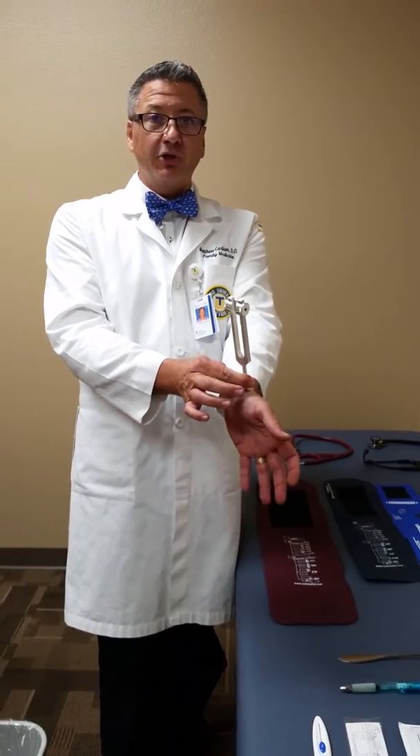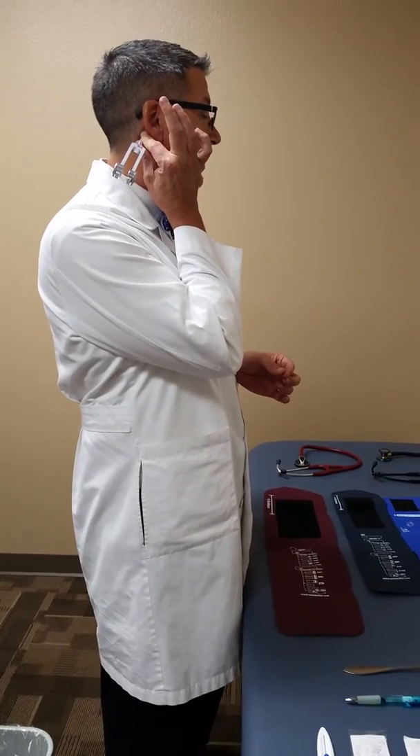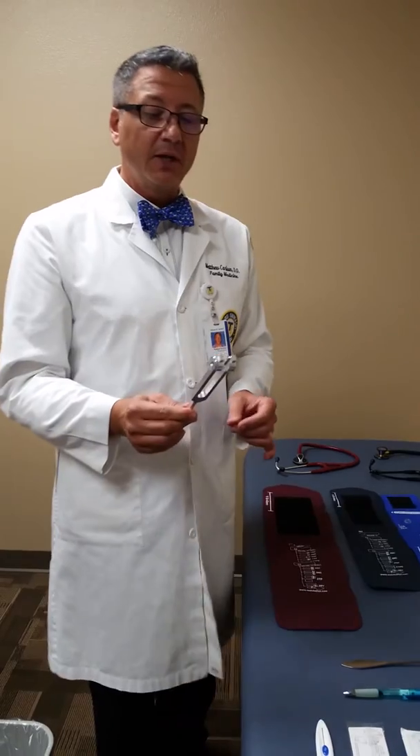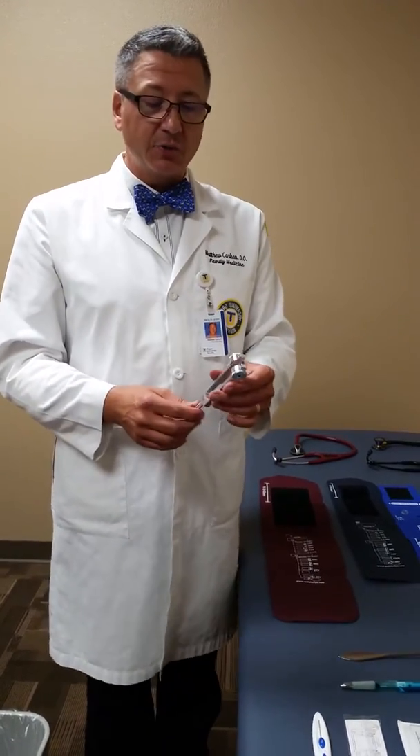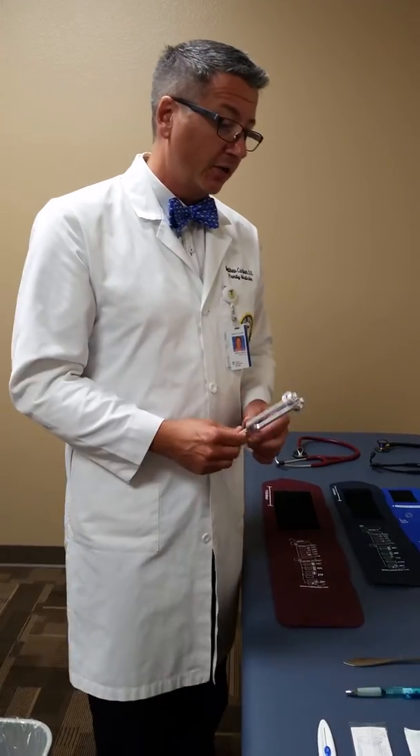The 256 Hz tuning fork can be used for vibratory sensation testing over a bony prominence, for hearing testing when placed against the mastoid process, and also for sensory testing of hot and cold — since it's made of metal, patients can report temperature sensation as well as vibratory sense.